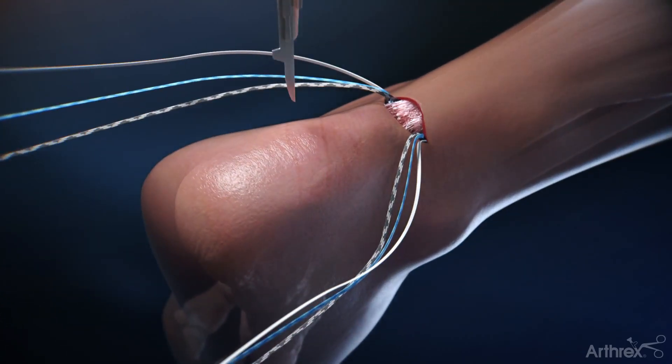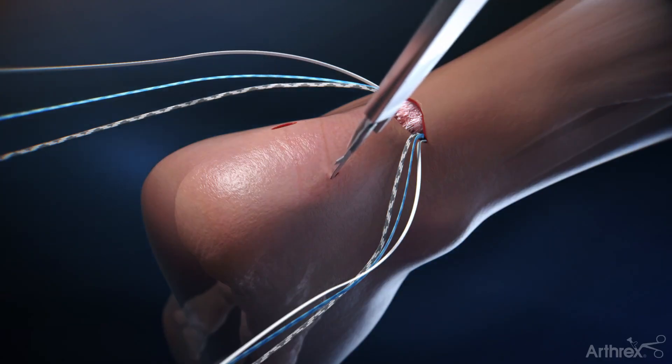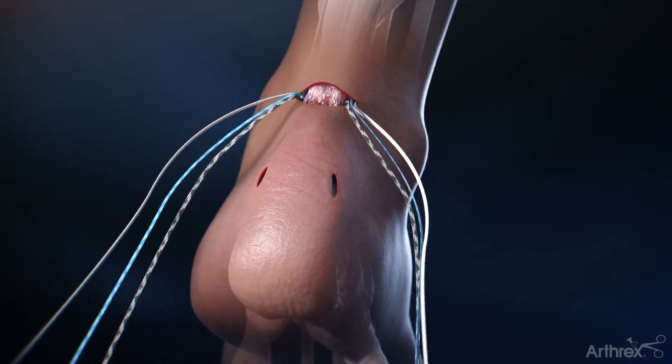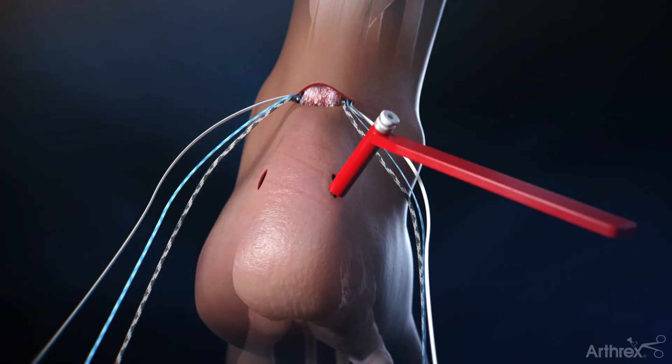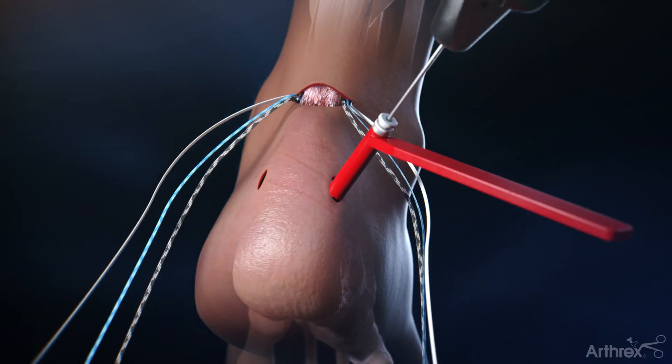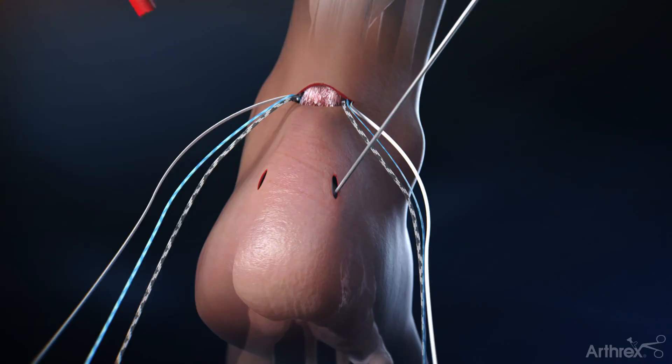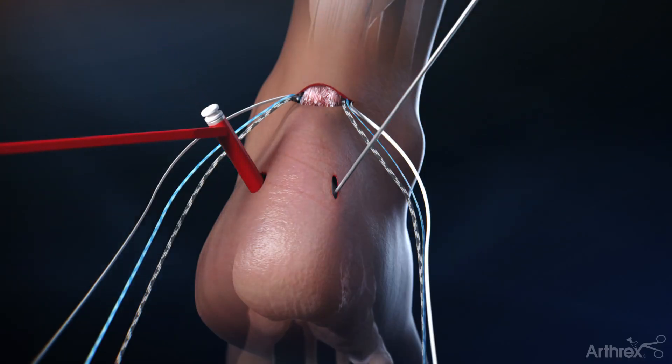Two stab incisions are made one centimeter below the superior aspect of the posterior calcaneal tuberosity, medial and lateral to the Achilles tendon. Within these two stab incisions, insert the guide wire utilizing the drill guide with the white centering sleeve at 45 degrees from the center line of the Achilles in the coronal plane and 45 degrees from posterior to anterior in the sagittal plane.